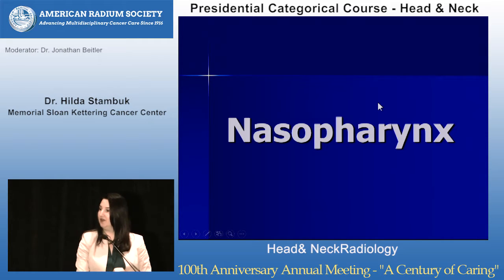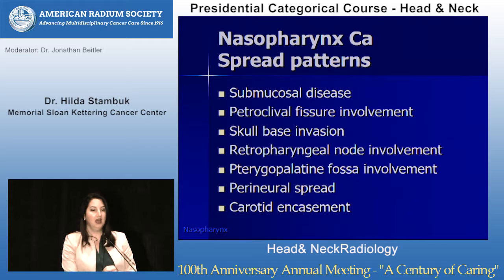So I wanted to go through various subsites. I'm going to show you some imaging. First, we're going to start with the nasopharynx because that is primarily treated by radiation therapy.